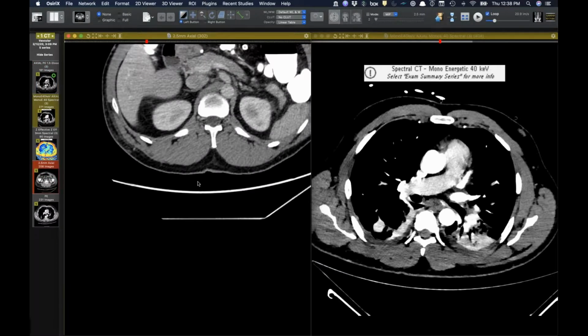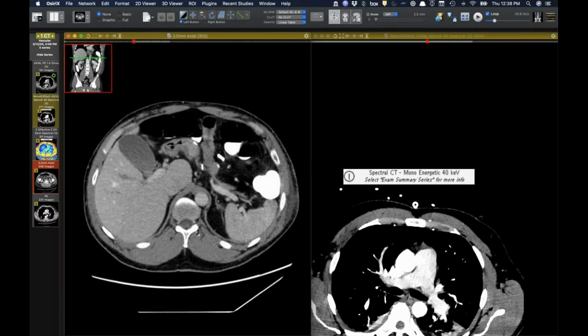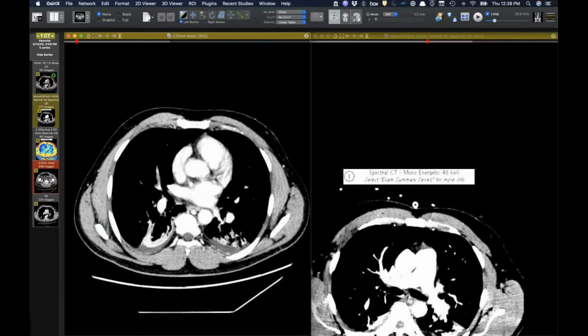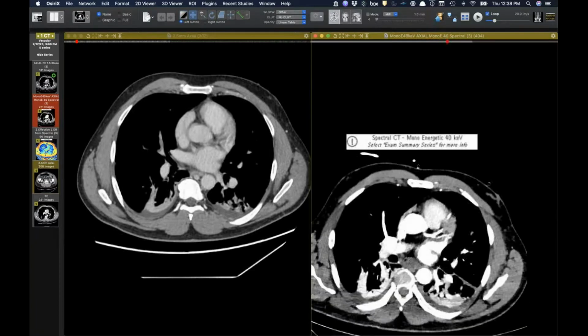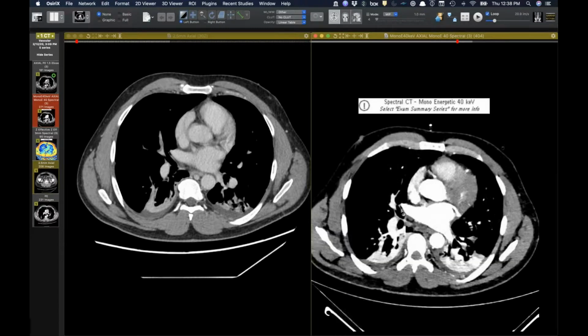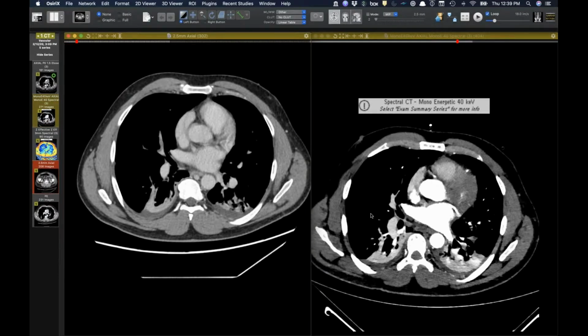Then of course, the next day, the patient gets an abdomen and pelvis CT. Here you can see there is unquestionably a pulmonary embolism right here now. The question is, was it there on this study the day before, or is this a pitfall of spectral CT where it doesn't perform like it is supposed to in a case like this? The pulmonologist was convinced that whatever happened was before the PE study, when the patient became tachycardic, and they were stable between this study and the abdomen and pelvis CT. So I'm trying to rectify this.